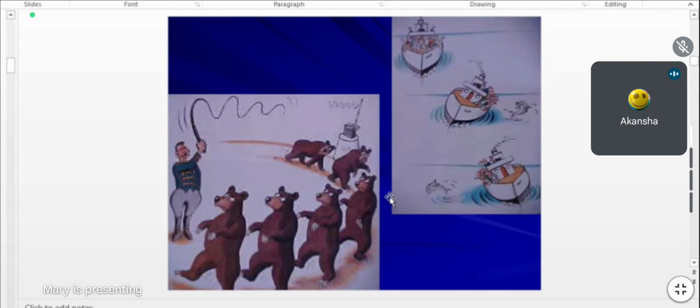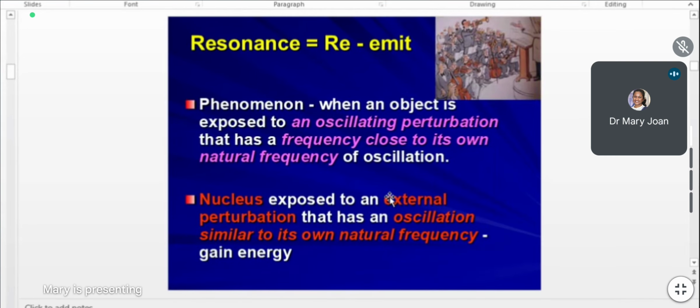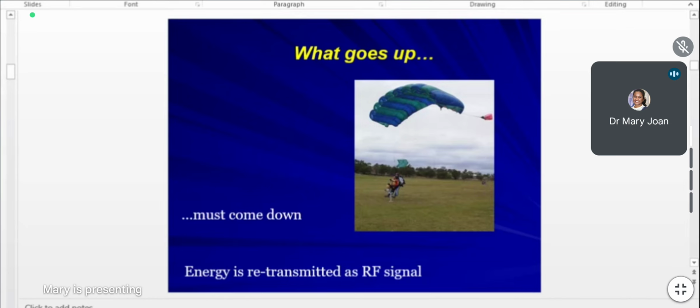Yes, ma'am. So that losing of energy will depend on whatever magnetic phase it was initially, like whether it was spin up, spin down, longitudinal magnetization, transverse magnetization, and what the frequency of it was, and so we get all this information from there. So how it is going back, that is the difference in going back to the initial magnetization, is the T1 and T2 and proton density and all.